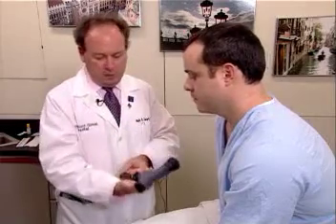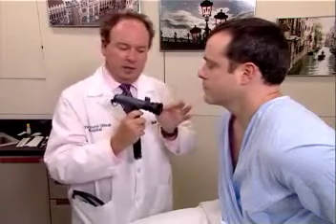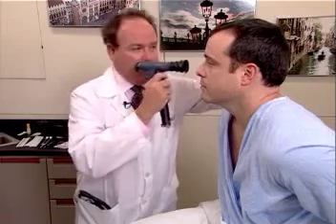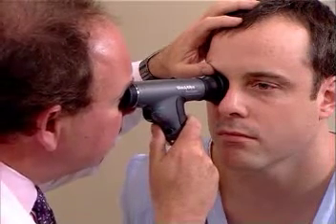First, one wants to use the continuous focusing wheel to focus on a distant subject, to get that subject in sharp focus. And then the equipment is used basically the same as your standard direct ophthalmoscope. A major difference is the eye cup. The eye cup, which aids in the stability of the unit, is applied directly to the patient's brow and is depressed about half of the length of the eye cup to visualize the red reflex.